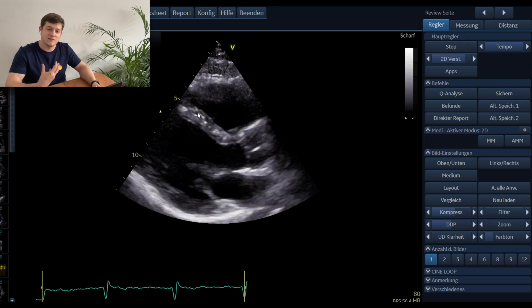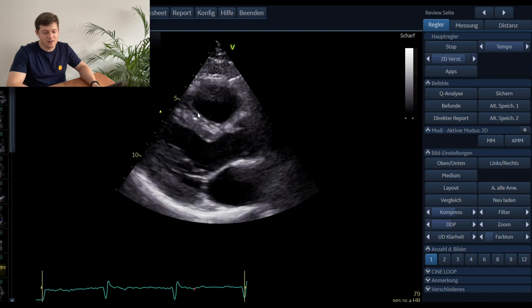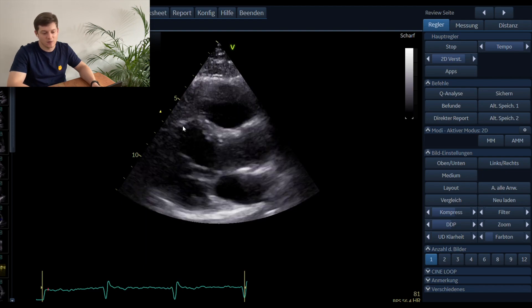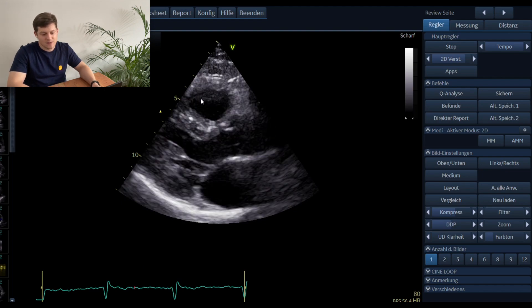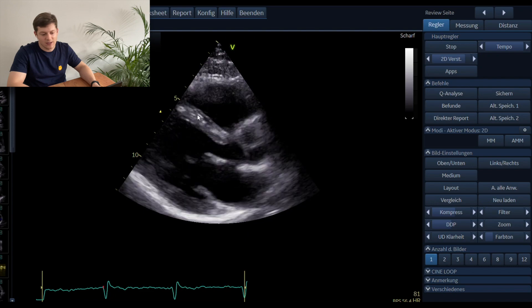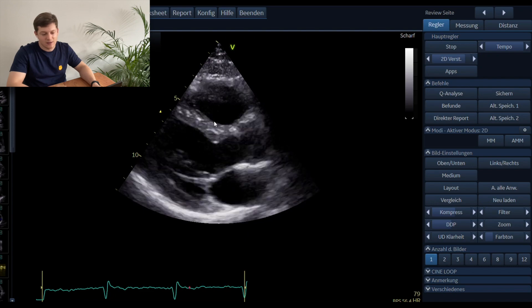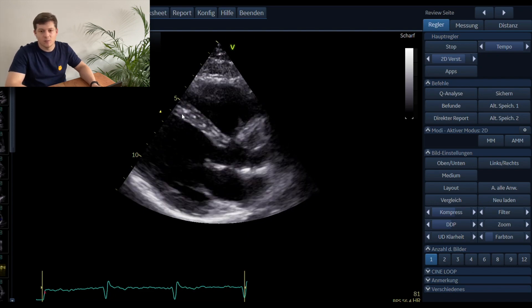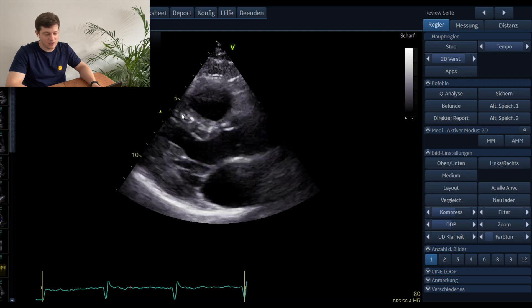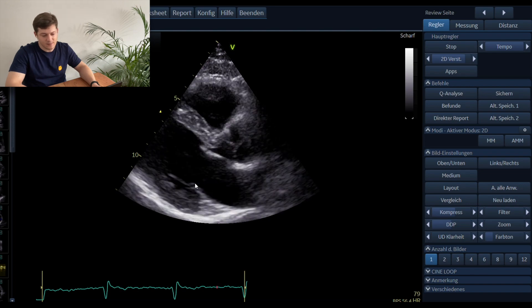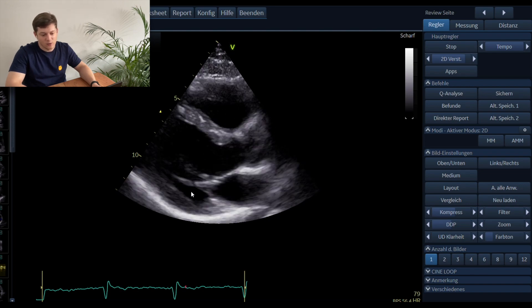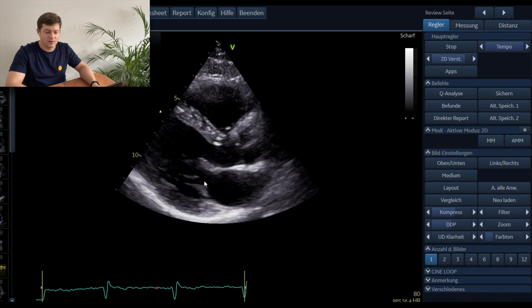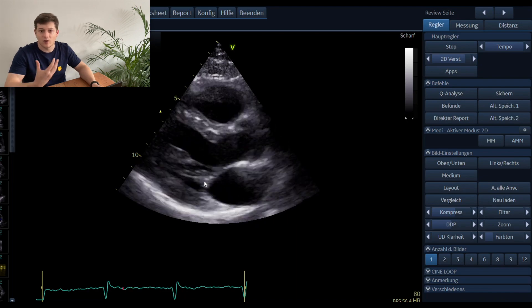You also see the posterior wall and the interventricular septum to check for left ventricular hypertrophy. Especially in this view you should measure the interventricular septum, because when it is truly in a longitudinal position you can measure it most accurately.